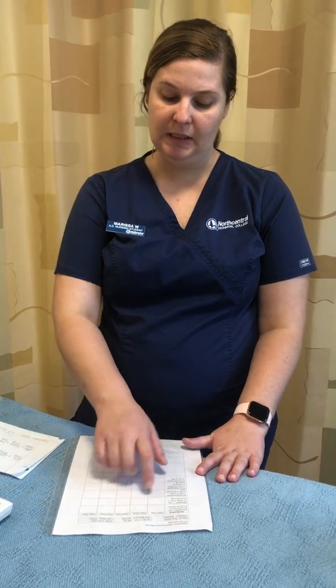Alright, my name is Marissa, and this is my video for my medication insertion through a central line. So the first thing I'm going to do is check my MAR or my order, and I'm going to note that my patient's name is Ron Smith, and he has allergies to morphine, and I'll double check his allergies once again later on once I'm in his room and when I'm grabbing the medication.